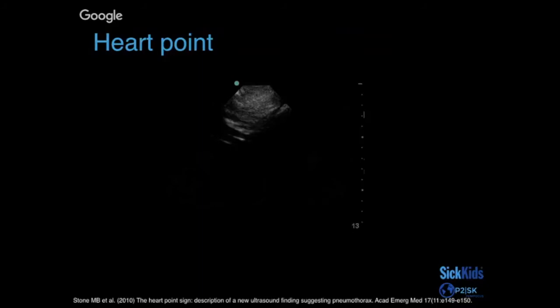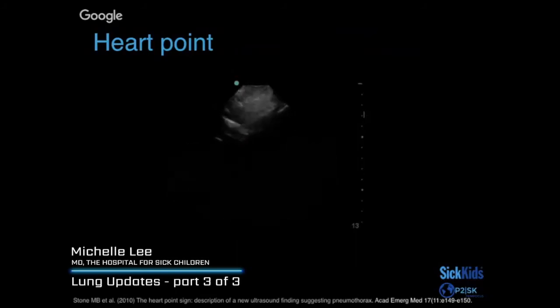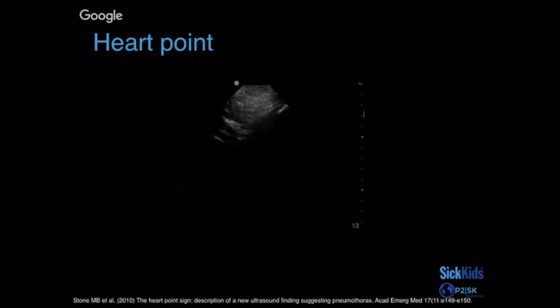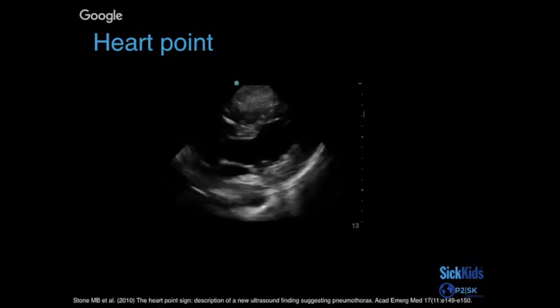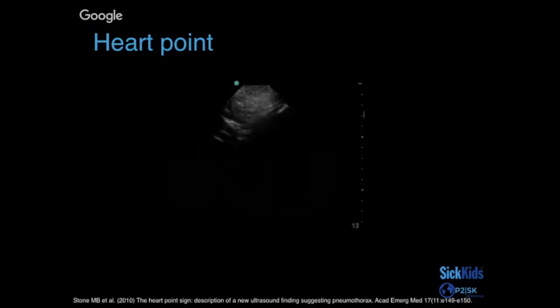This was a case described in 2010 in an adult with left-sided chest pain. When the adult presented with chest pain, he very intuitively reached for a phased array probe doing a focused cardiac scan. The heart looked fine in the subcostal view, but then when he looked in the parasternal area, he got this flickering phenomenon where the heart was clearly visible in late diastole but then disappeared in mid-systole and reappeared again, giving this beat-to-beat variation in the visualization of the heart. He suspected that air was being transiently interposed between the chest wall and the heart during the cardiac cycle.